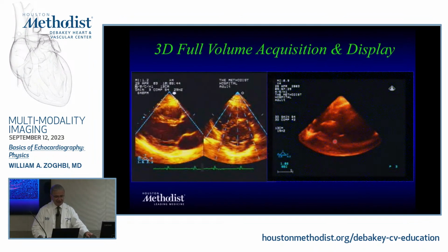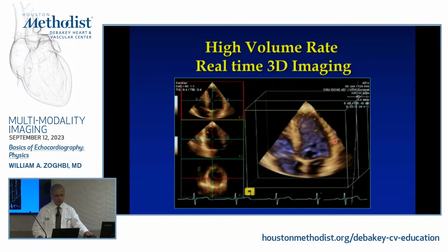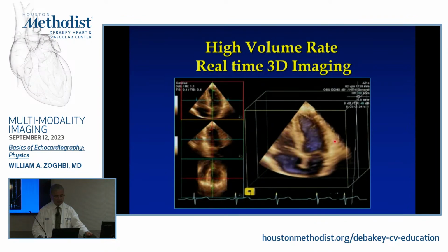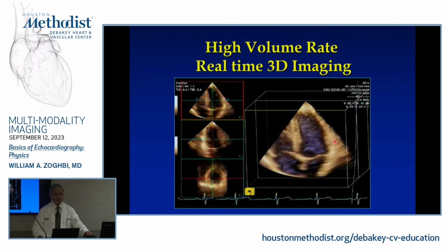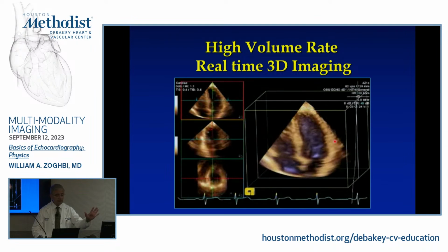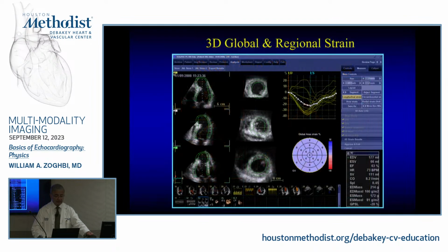All right, so that's the beauty of 3D, and we're underusing it a bit, and I will push, once we have all our equipment with 3D, and I think the vast majority are nowadays, to use it as much as possible and tweak it, because it is not completely automated. You have to work at it, to come up with a good estimation of function, particularly in multiple regional abnormalities of the heart, where even a 2D quantitation may be underestimating or overestimating.